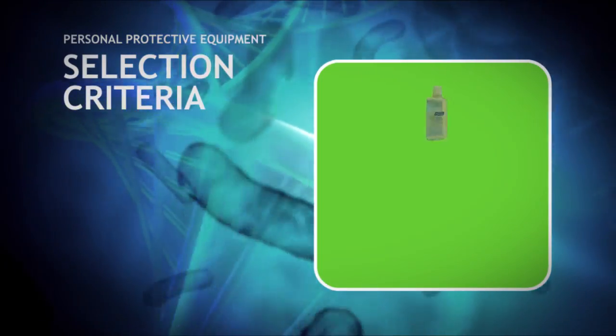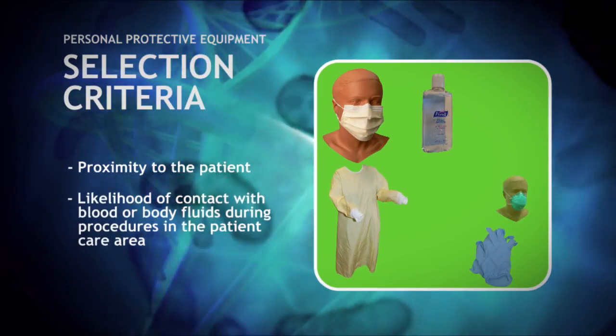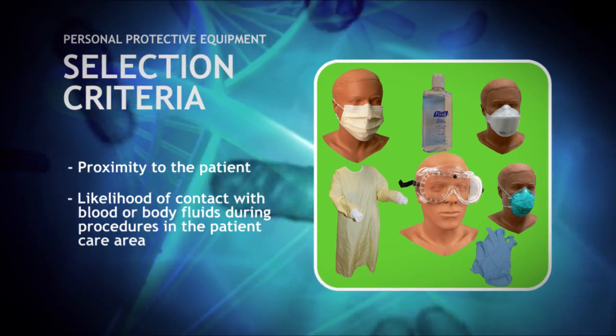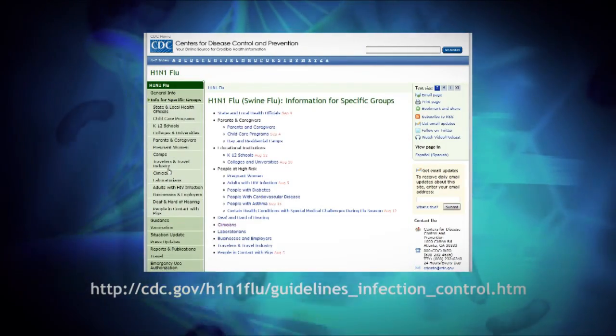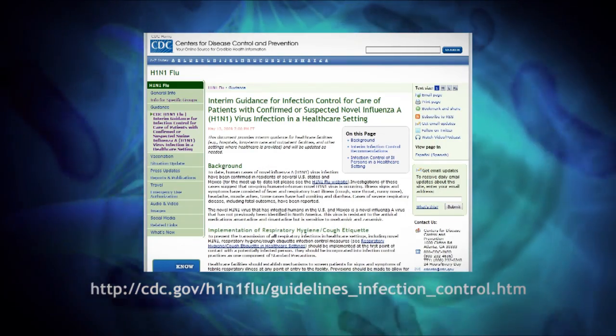Personal protective equipment should be selected based upon proximity to the patient and the likelihood of contact with any blood or body fluids during procedures in the patient care area. This video will demonstrate the proper sequence for doffing personal protective equipment based on guidelines from the Centers for Disease Control.